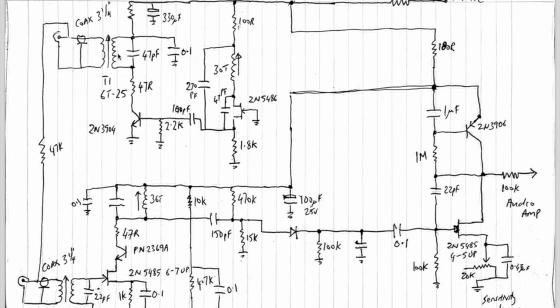For those who want to build this, these tuned circuits are roughly about 5 or 6 microhenries, with these ones with slugs in them. Standard radio coils will do, about 6 millimeter in diameter, and seems to be quite stable. I didn't have any problems getting this thing to oscillate. It worked more or less first time.